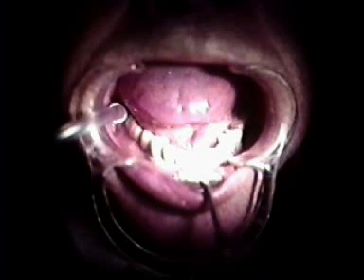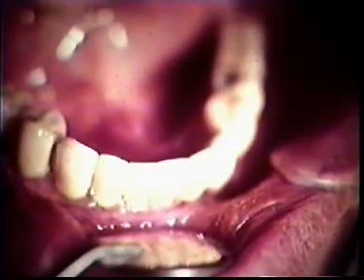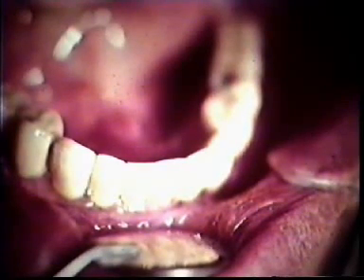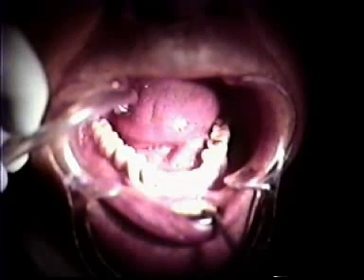We cement provisionals, and it's not necessary to use provisional in the posterior areas. The patient goes home with teeth, and after we check the occlusion. And this is a view of the lower arch when we finished. And you can see the bicuspid crown and the immediate PIT-EC implant in 1991. And this is the final restoration and the last photograph taken in November of 1995, almost 6 years without problems. After we put the upper post, trying again to get the best parallelism, and that's a close-up. And this is the upper and lower final restoration.